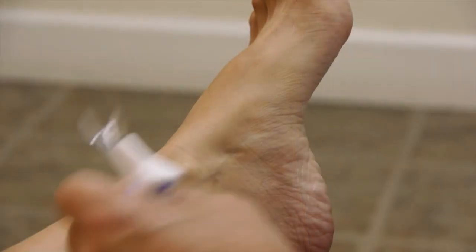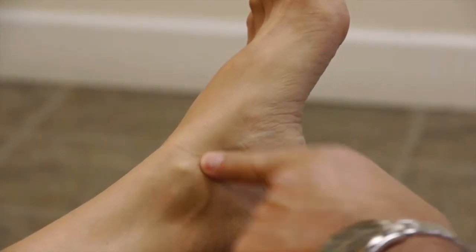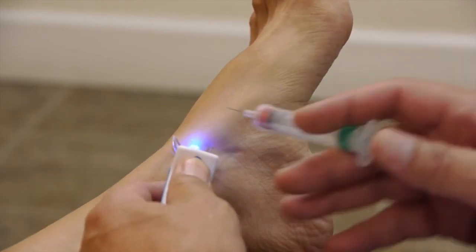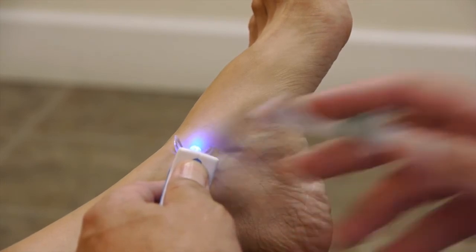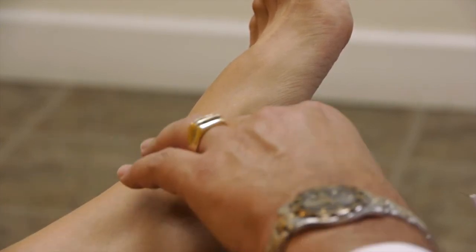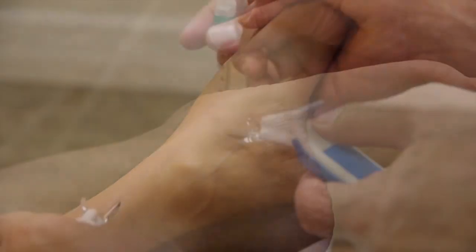Injecting the ankle joint, I know that the ankle joint is exactly at the level of the distal aspect of the medial malleolus. So I put the device right here, and I inject just like this. And I go right across the ankle joint, just like that, all the way across. Typically they do not feel at all when the needle is going into the ankle joint, but they may feel the infiltration of the medication.